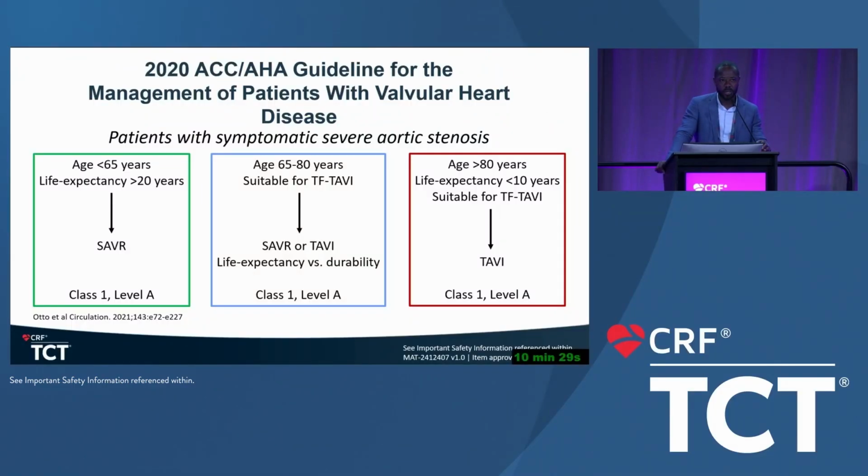Yeah. So we understand you said the coronary access. That's true. The hemodynamics, we can understand that. So let me go back to your question, Bassem. We now have that cusp overlap technique. We go higher and higher. We have the markers with the Navitor vision, so we can aim quite high with the device. So is it going to impact our ability to do a redo procedure? Because the higher you go, the taller the neo skirt is going to be for the redo procedure.